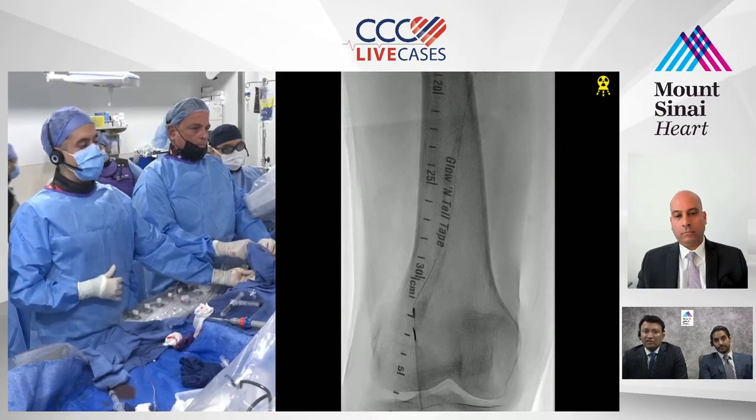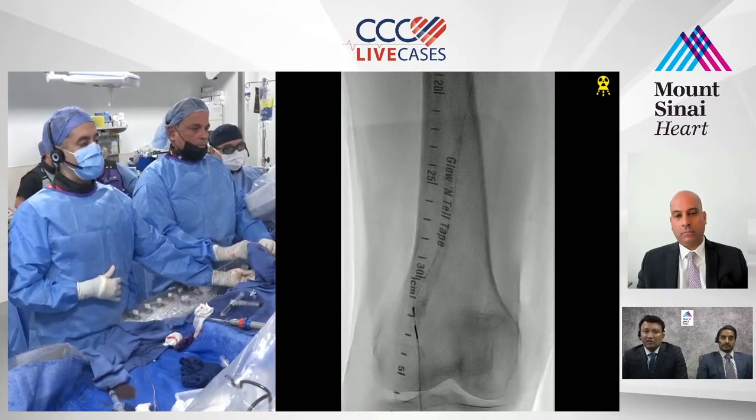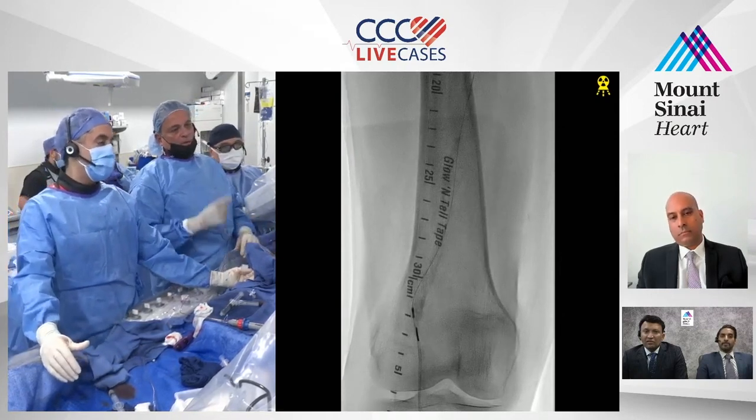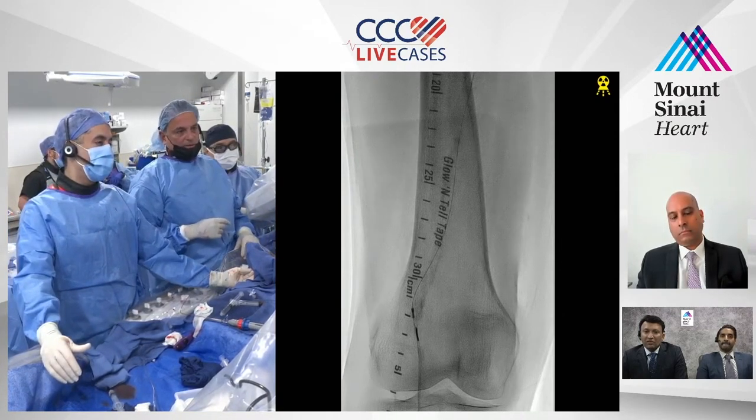Around, but definitely much bulkier. And that way, Outback delivers better. But again, you're right, it's stiff. That's why I guess it delivers better. The question is, should we poke a hole and try with another wire through the other hole and see where it goes? Let's try that.